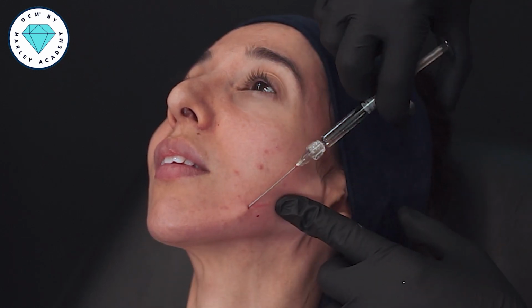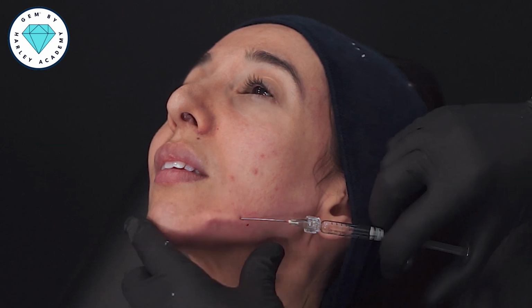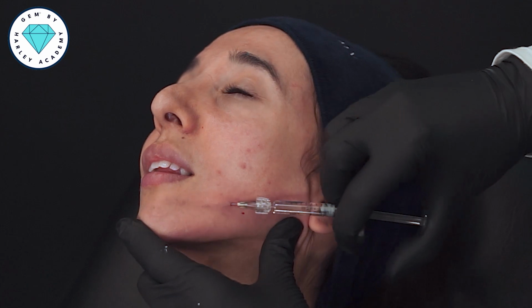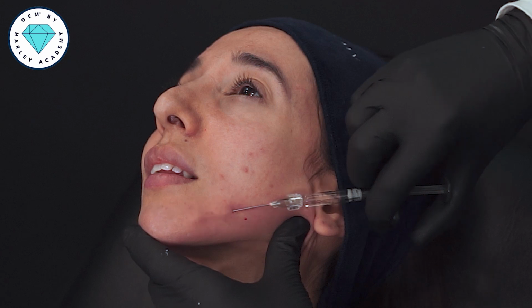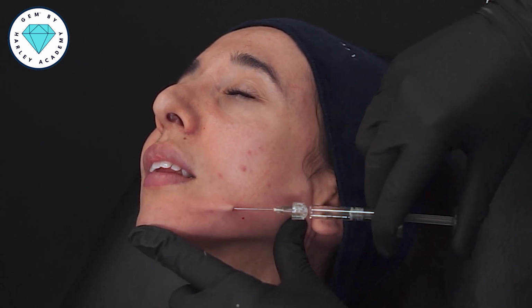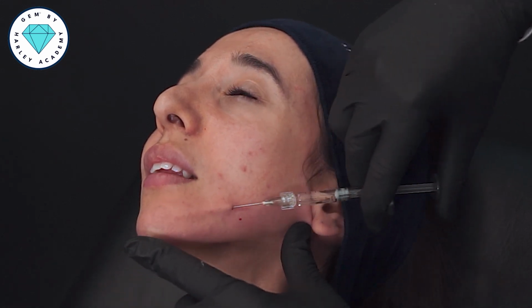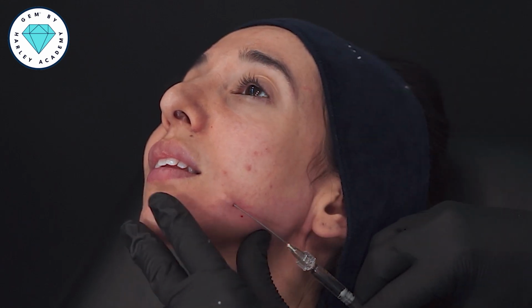Worth mentioning that when we start to detach the muscle from the skin like this, it can just lead to some bruising. It doesn't mean that we've clipped a major vessel. It just means that we've started to separate those layers, because in this part of the face, we have a different skin formation, and the skin is very tightly adherent to the underlying muscle and the subcutaneous fat. So we can separate it like this while it's fanning into the labiomental crease, into the pre-jowl area, and into the marionette area as well.